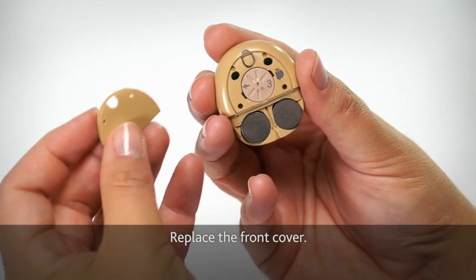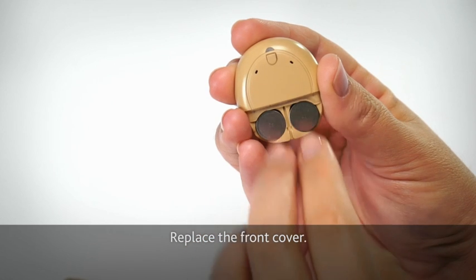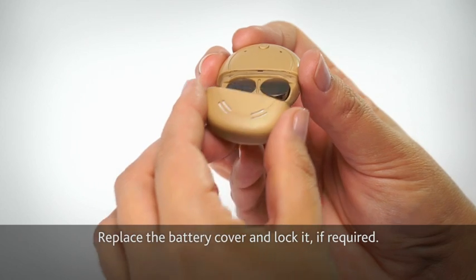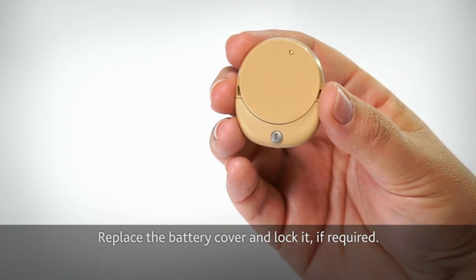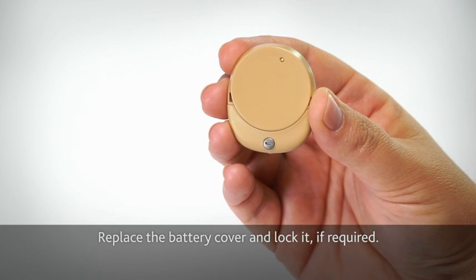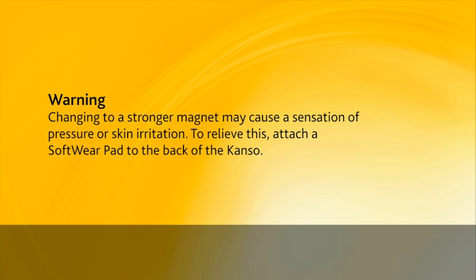Replace the front cover. Replace the battery cover and lock it if required. Changing to a stronger magnet may cause a sensation of pressure or skin irritation. To relieve this, attach a softpad to the back of the Kanso.